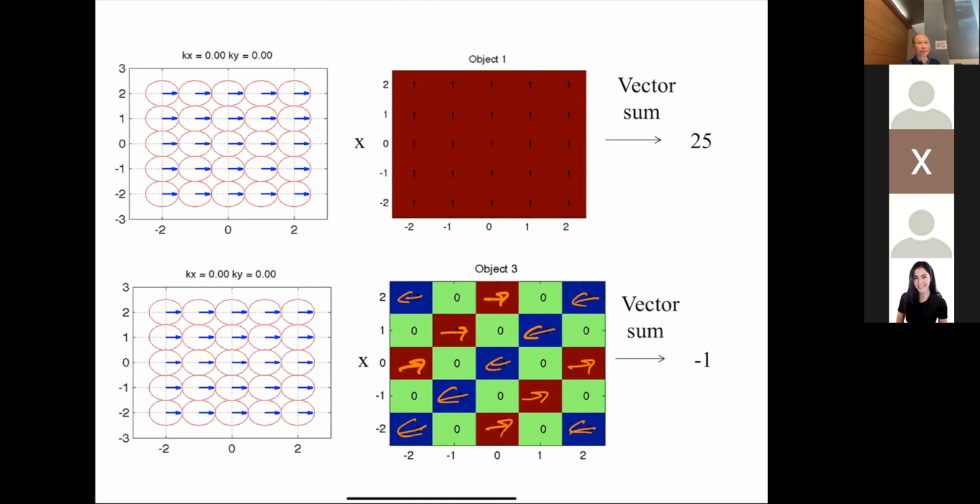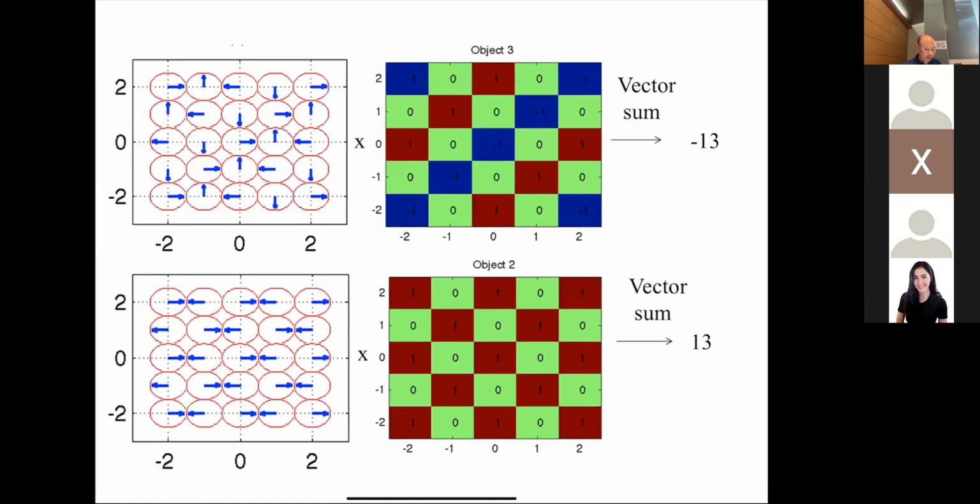But in practice, the system itself is not perfect. If you scan for 24 hours, the system is drifting, the B0 field is drifting, things are happening. So you'd have to correct for all those things too. But yeah, that's a good question.